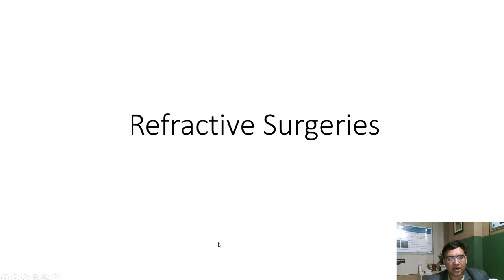So friends, our topic for the day is refractive surgeries. Let's say a patient has come with a -3 or -4 refractive error and wants freedom from the spectacles. For this, a surgery that we can do is basically classified under the refractive surgeries.